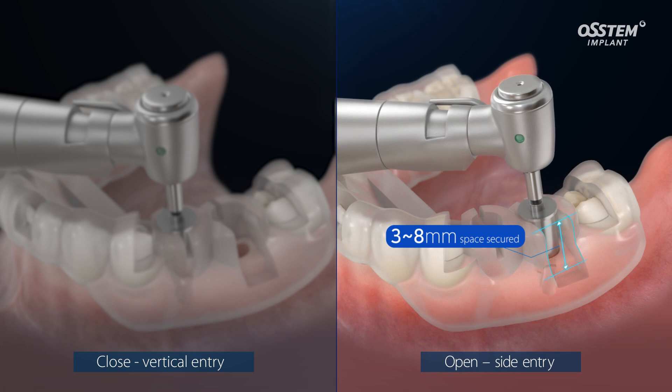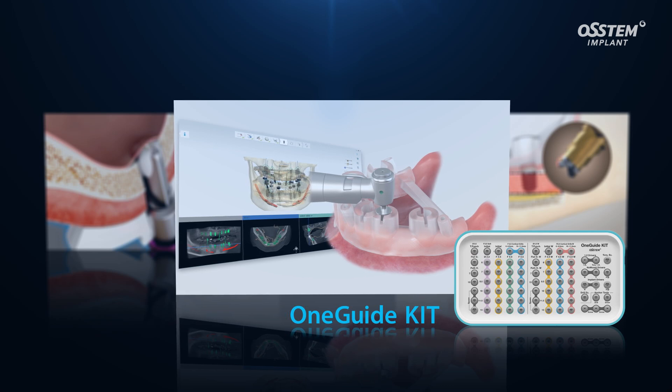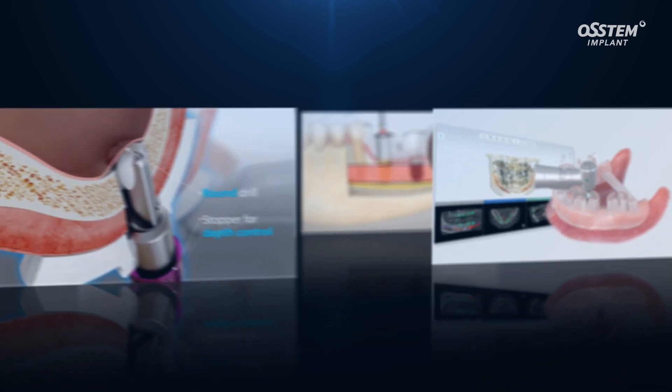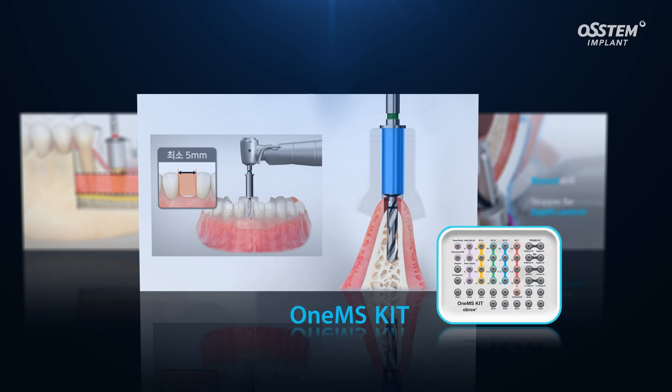The open type hole helps to secure additional vertical space. One Guide can be used for various clinical purposes. The One Guide kit covers cases from single to fully edentulous, and the One Cast kit is for maxillary sinus lift surgery.